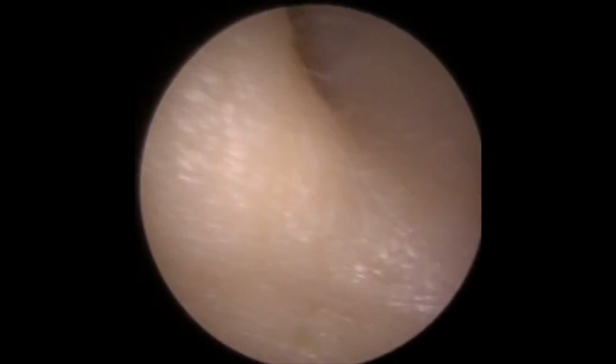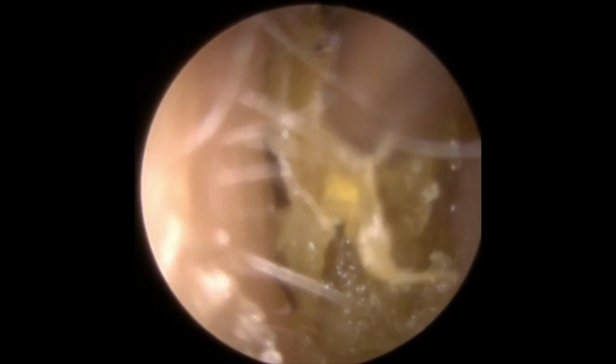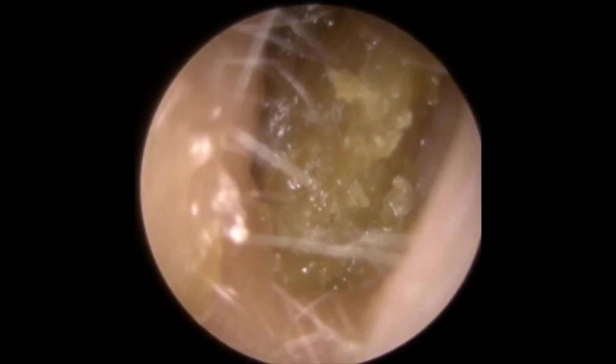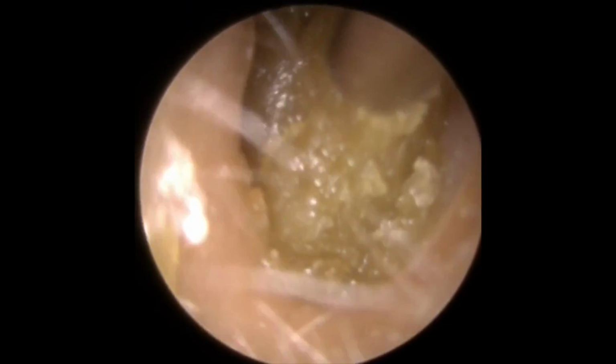And you can see just how difficult this is. This wax is rock solid, but it is brittle. So what I'm trying to do is just break little pieces away, and we're making this ever so much smaller every time we take a piece away, until we can try and get it small enough to fit out this canal.